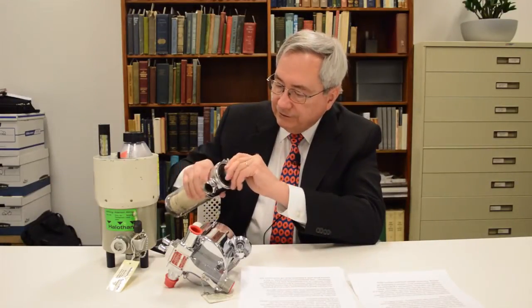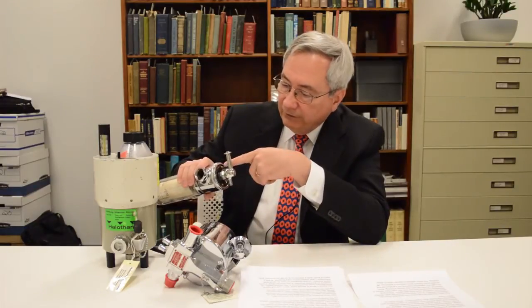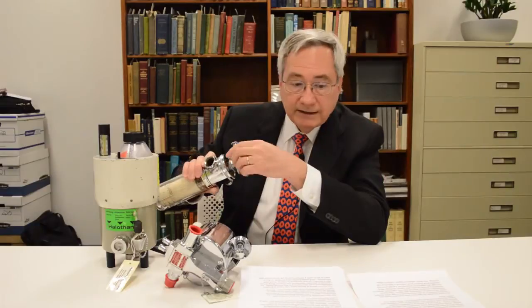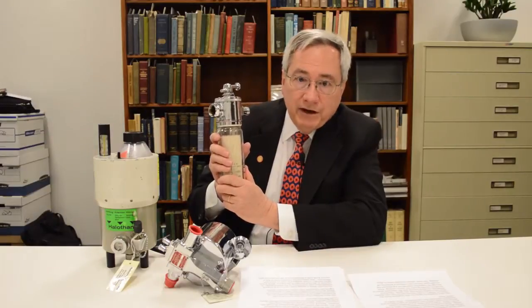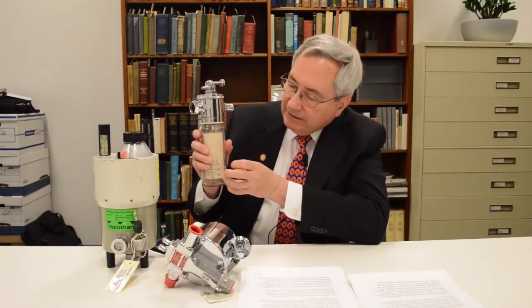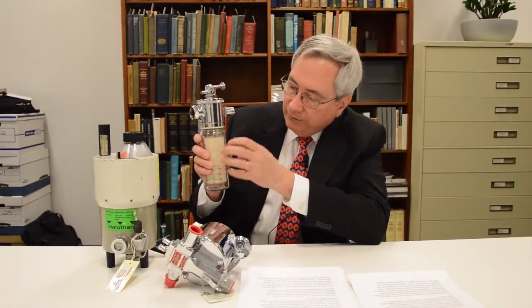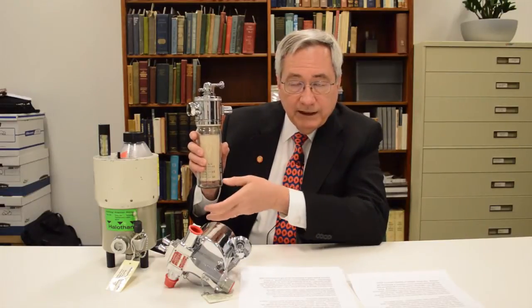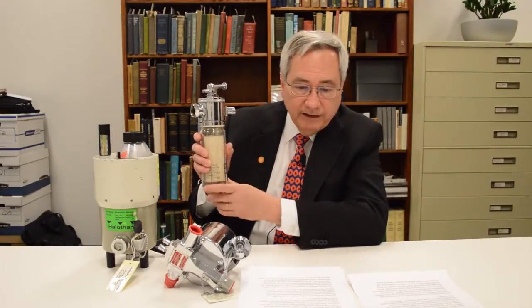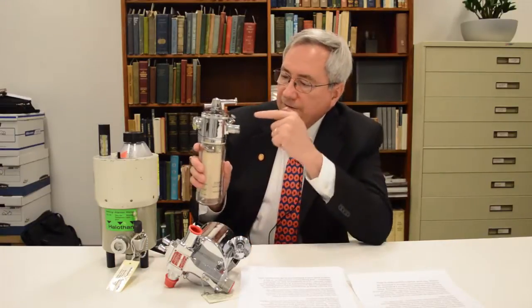So the flow was controllable because the dial let you pick different numbers. However, it was not calibrated, so there was no particular quantity that was associated with either a number 4 setting or a number 8 setting. Additionally, this vaporizer had no temperature compensation. So as the ether in the container would vaporize out, it would cool it down, and so subsequently even less anesthetic would be delivered. Additionally, this was used as a flow-through vaporizer.